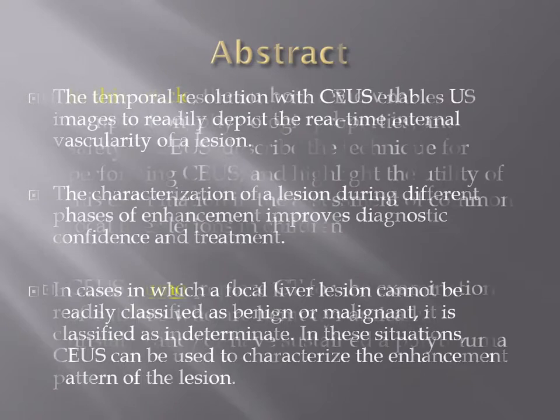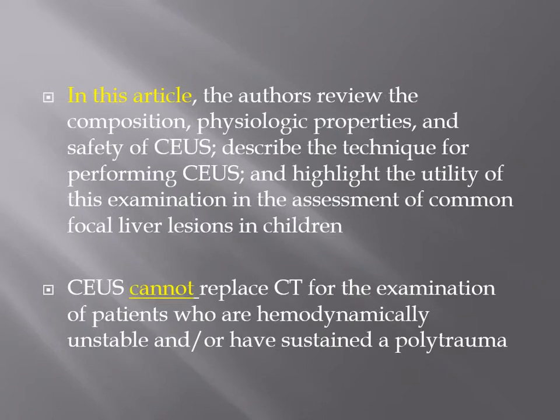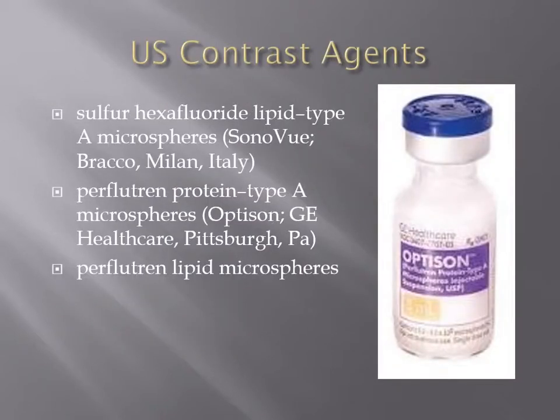This article is based on research done in 2014 and 2016, and through this the authors reviewed the composition, the physiological properties, and the safety of these agents. Later, in the next slides, we will show the techniques and highlight the utility of this examination in the assessment of these focal lesions. However, this technique cannot replace CT for the examination of patients who are hemodynamically unstable or who have sustained multiple trauma.